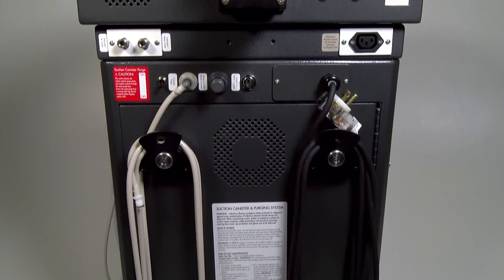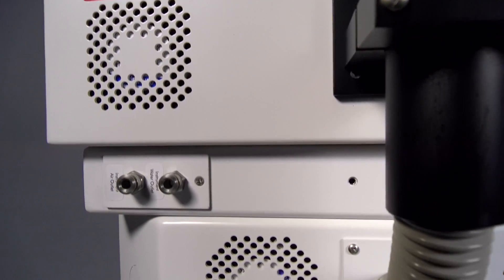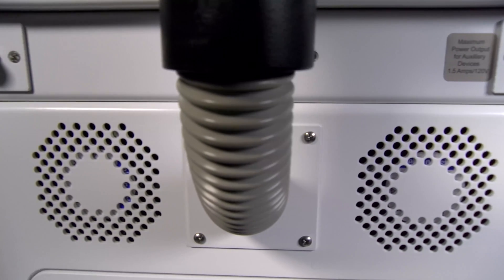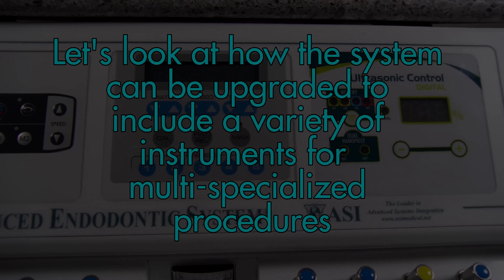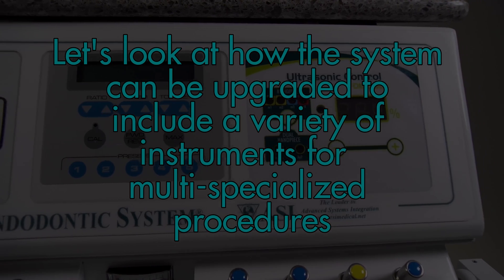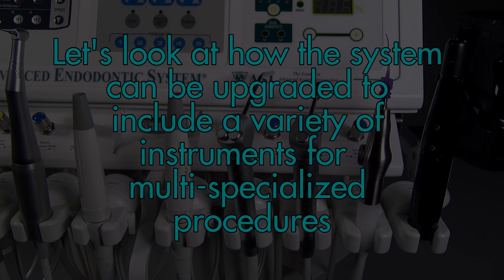The system features advanced circuit breaker technology and is fan cooled to provide air movement over internal electronic instruments. Now that we have covered the standard system features, let's take a look at how the system can be upgraded to include a variety of instruments for multi-specialized procedures.